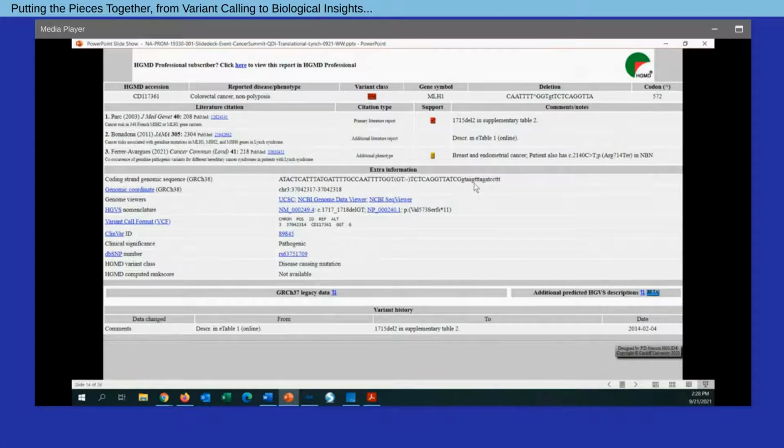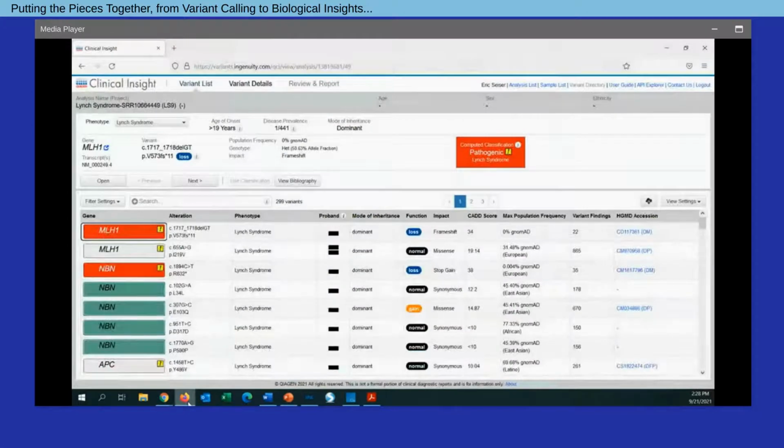So what I'd like to do now is go ahead and show everybody how we interrogate this within the software. I've just opened up Qiagen Clinical Insights Interpret Translational, and this is a web-based tool. I've already gone ahead and analyzed my VCF file from a sample of interest. This is the LS9 sample from the study. And the analysis itself is very simple.